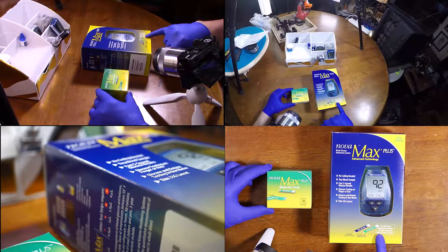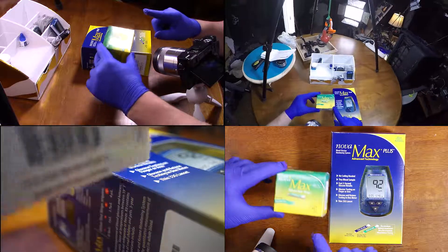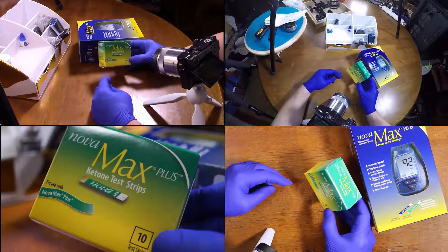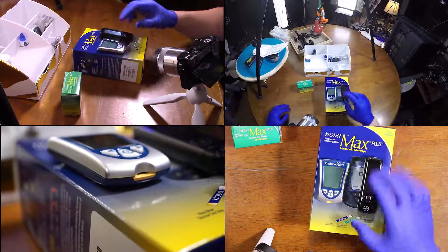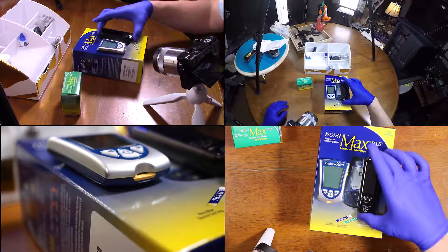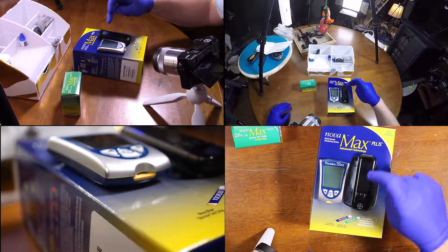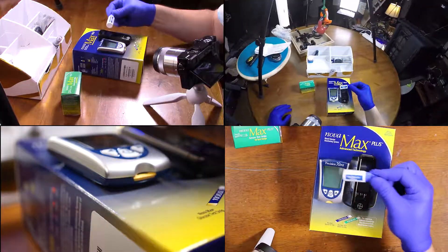The American Diabetes Association now recommends blood ketone testing. We should see the drop in these items because they are way expensive. I had done a tutorial on this Precision Extra and did a comparison with this Contour. I do like this, although these guys are outdated and so is this control solution.